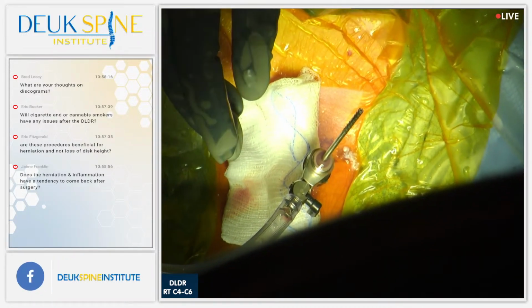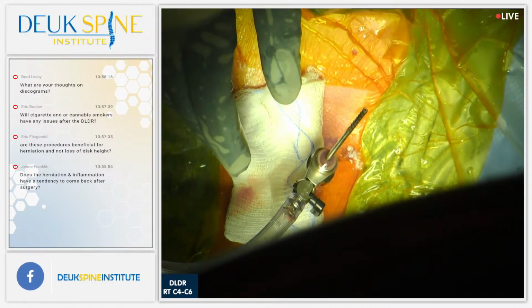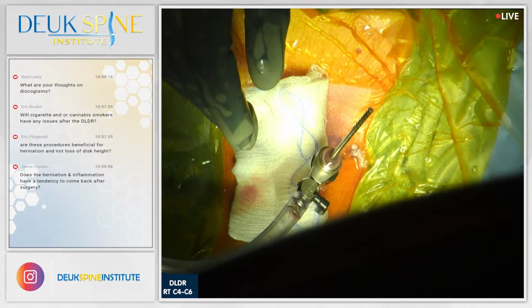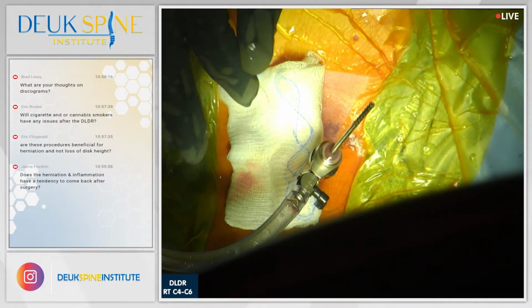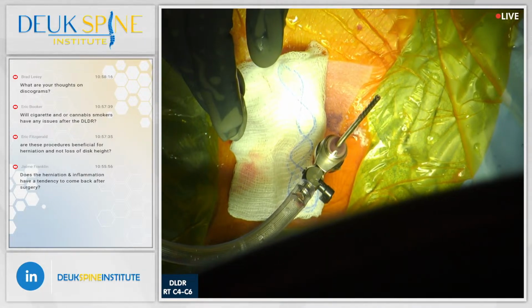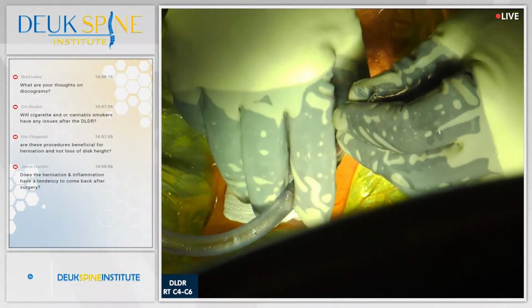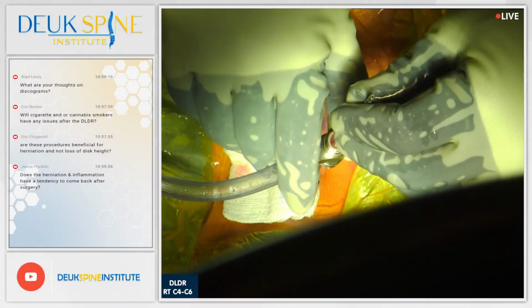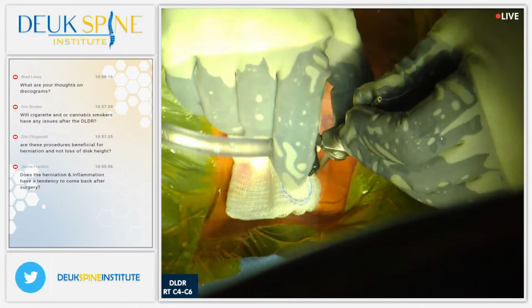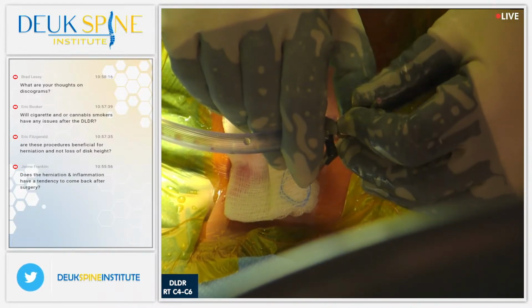We're moving up. Let's get a good picture. No. Before I take another question, I want to make this move. Can you hold the head, please? Inline traction. All right. There's too much light in my eyes, guys. I don't know why we have all these lights on. I need to be able to see this screen.